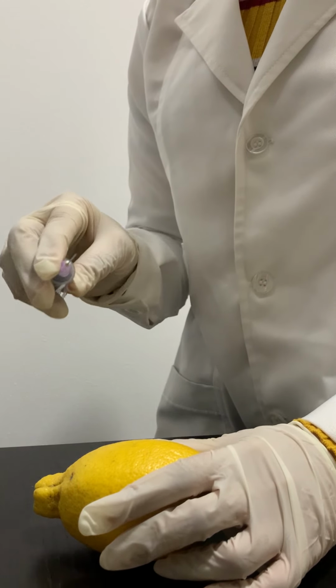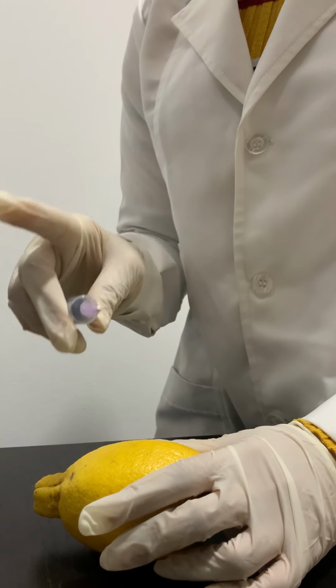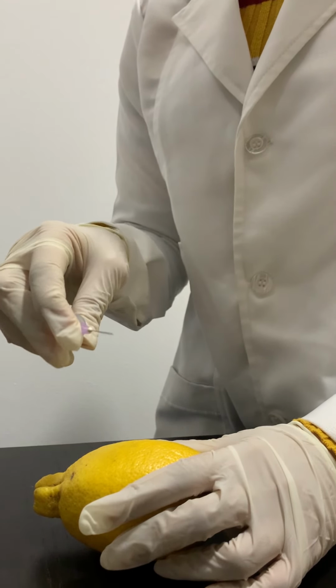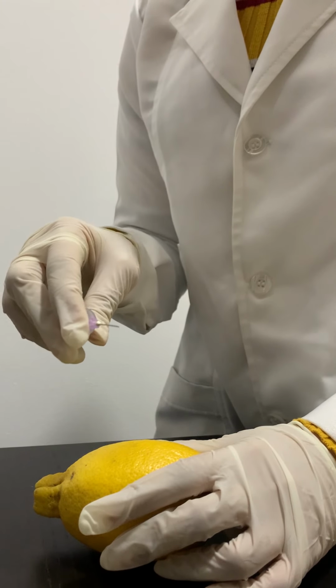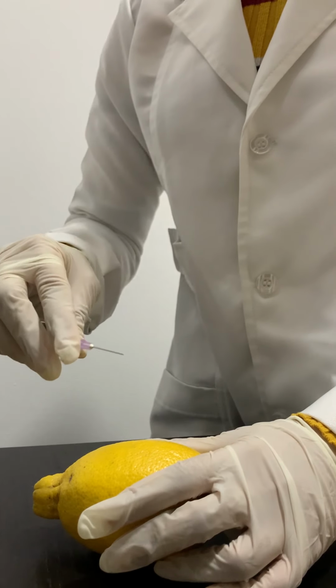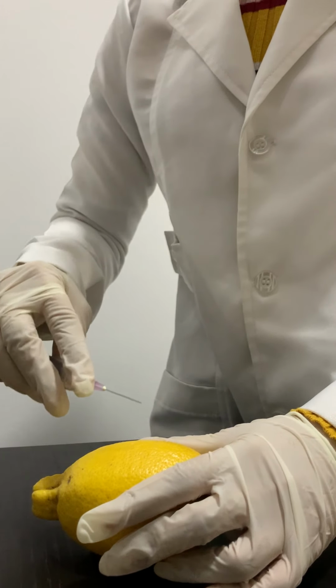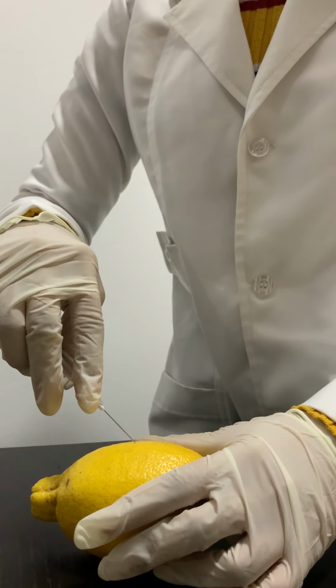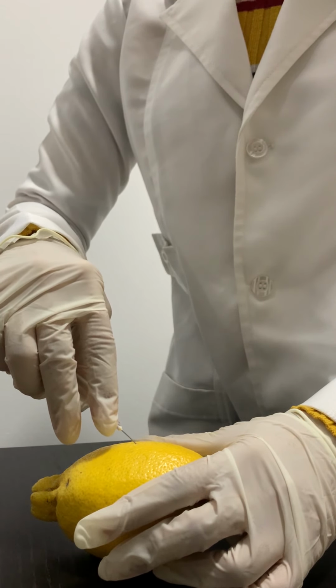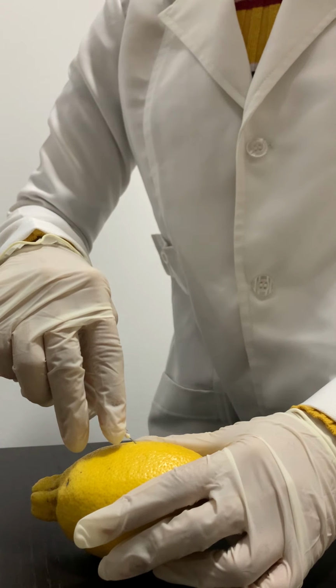The needle is held in such a way that the index finger is below the flash chamber or needle adapter, like this, and the rest of the fingers will be supporting the needle. It's advanced at 45 degrees to the skin. Like this.